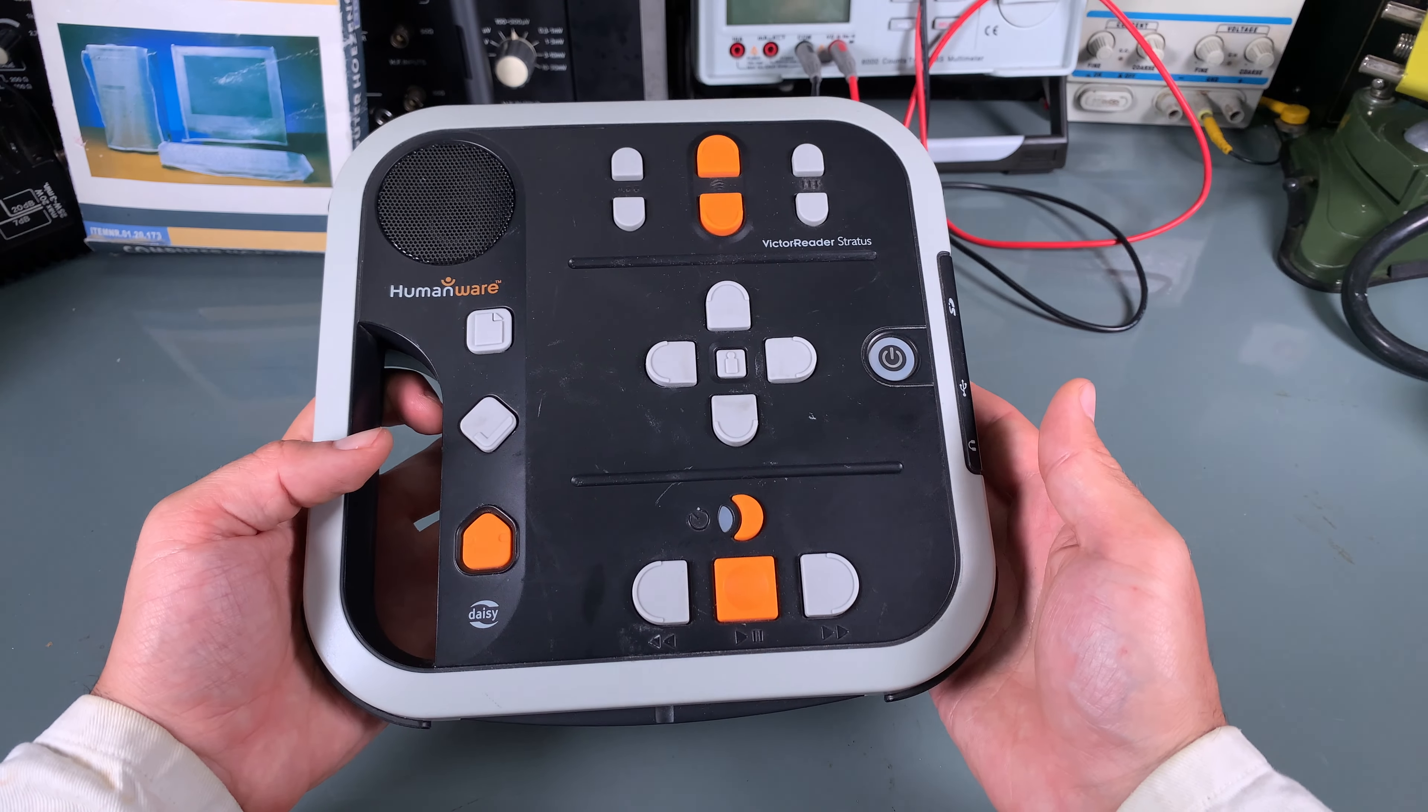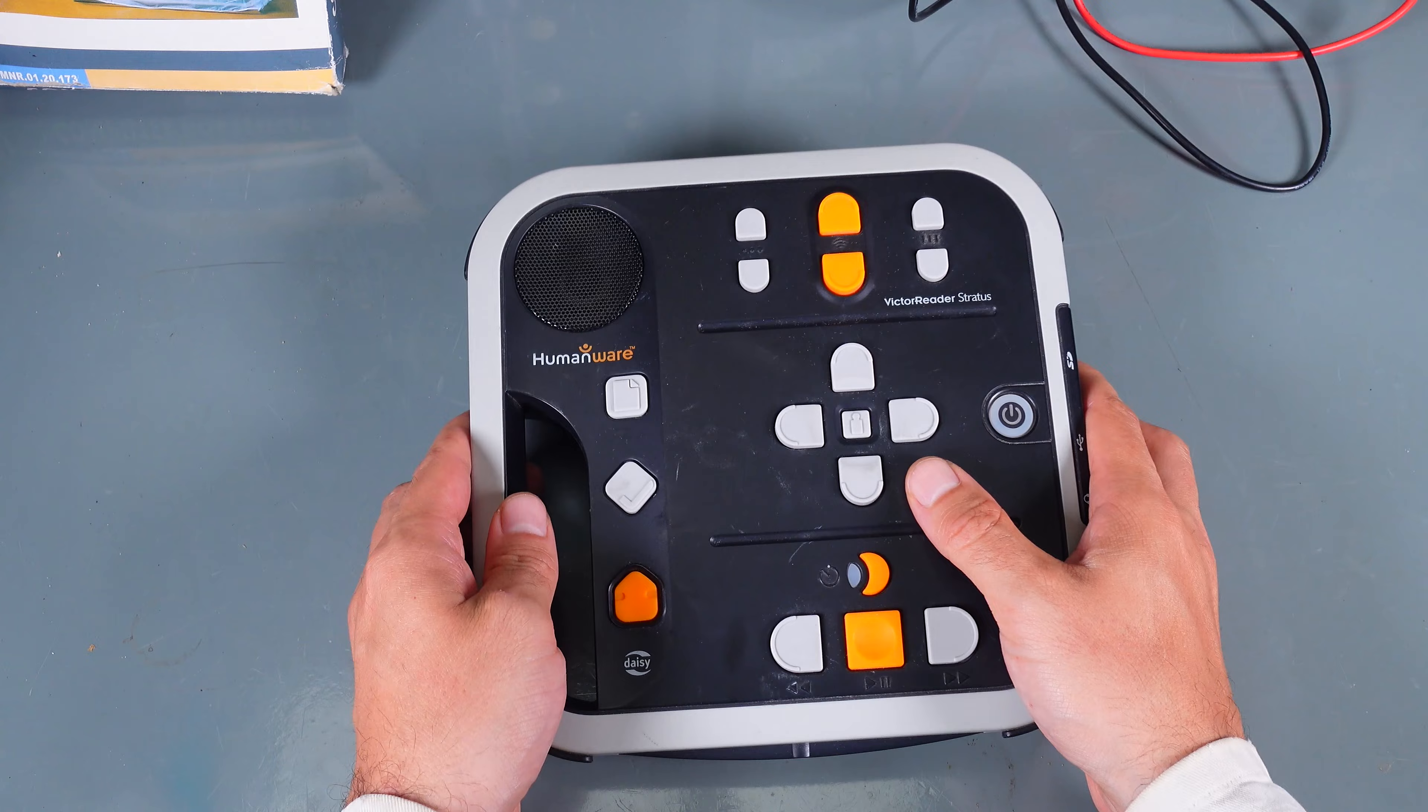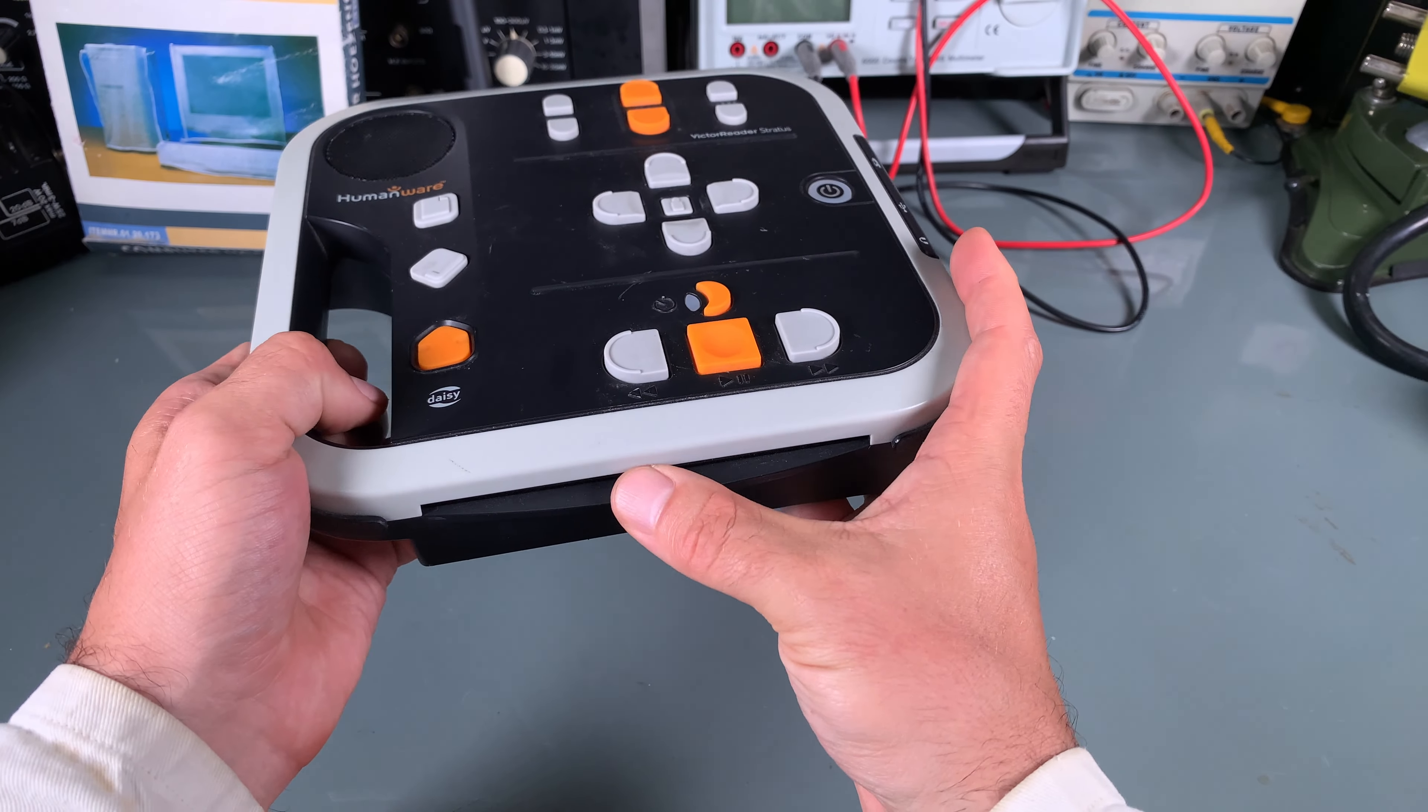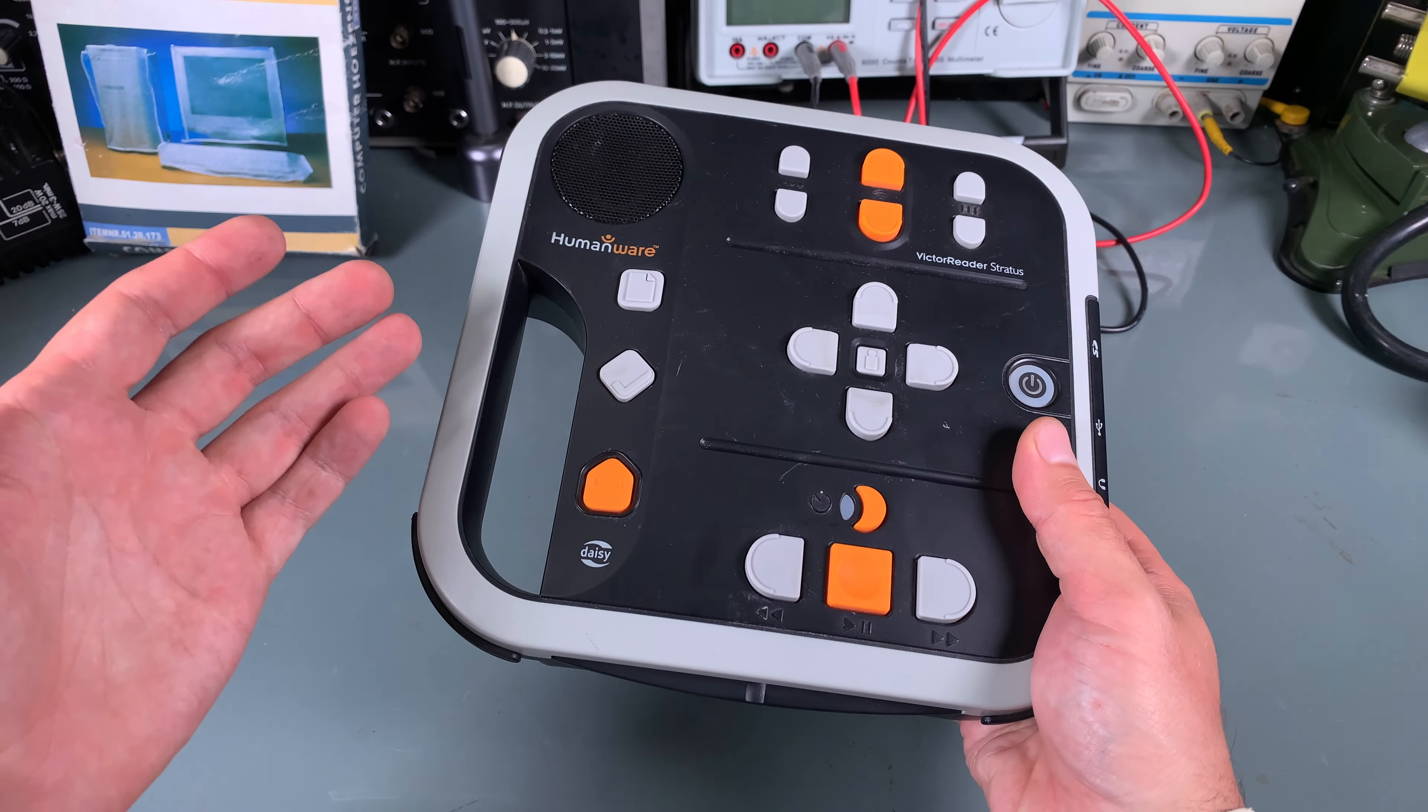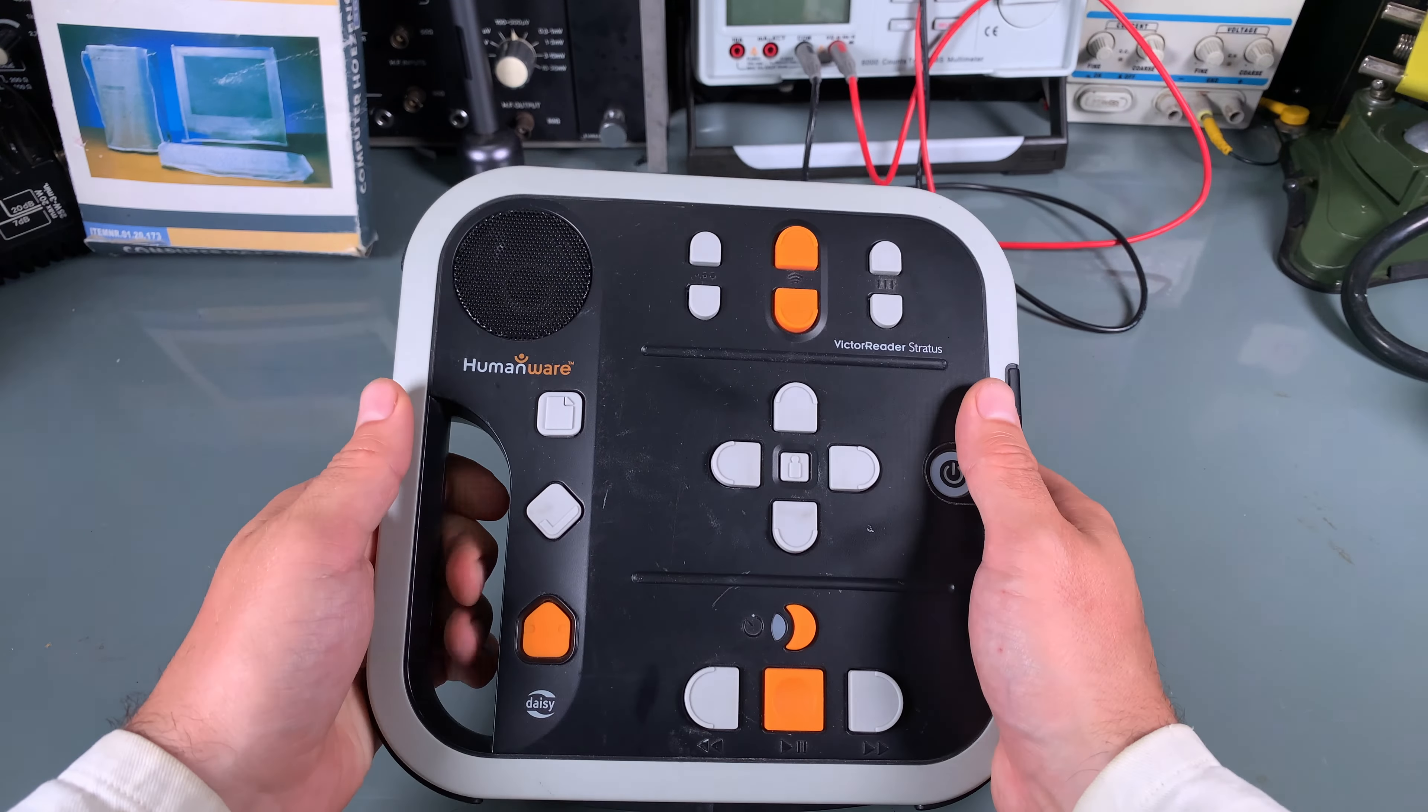It is an audio book reader. This device can be used for reading books or listening to regular audio books. You can load them from USB, SD card, or CD-ROM drive, but it's mainly used with the DAISY format. You can go to a library, borrow a book, slot it in, and read it very nicely with lots of control.